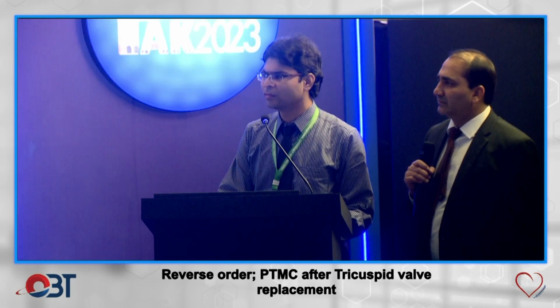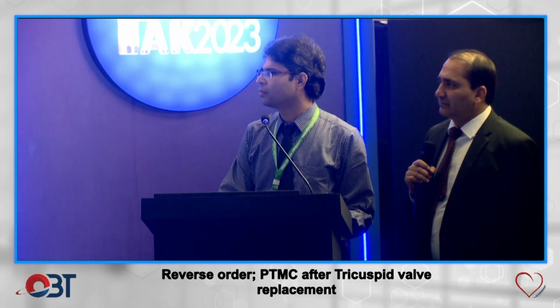What was new thing in your point of view to present this case over here? Like you were telling us, it's actually reverse loop order. So what was the most compelling indication for taking this reverse loop order? आपने reverse loop order जो बनाया था PTMC करने के लिए, उसको क्यों बनाया था? कोई खास वजह थी उसकी? We didn't do that because you are not going to touch the tricuspid valve, and you are going from a venous system by interatrial septal puncture and then you are going into the LA and then going to PTMC.